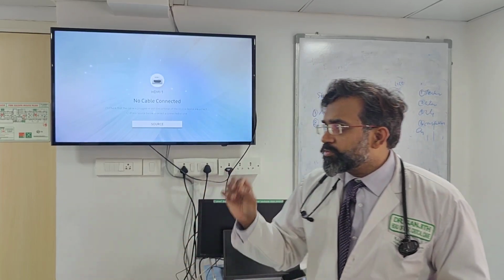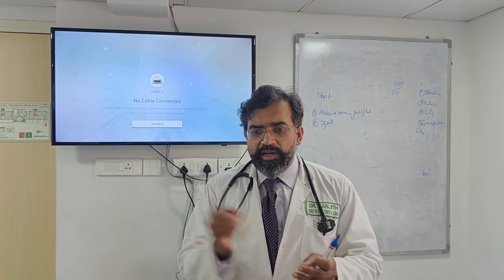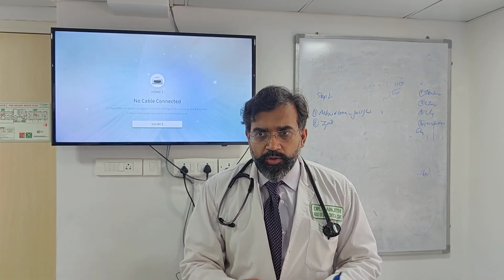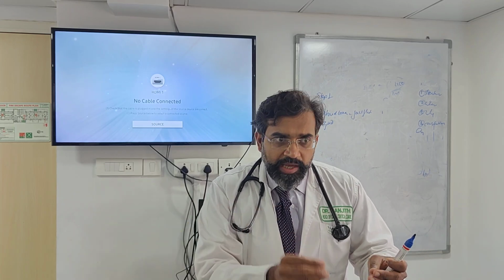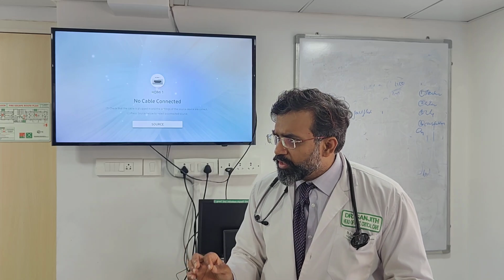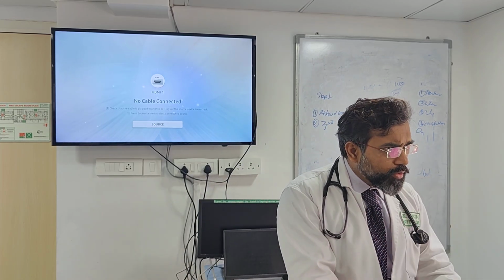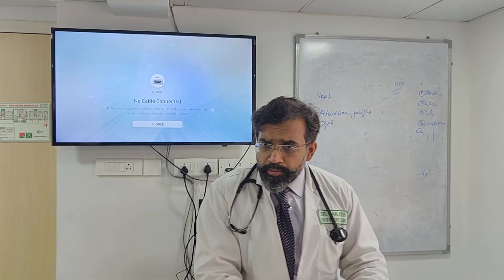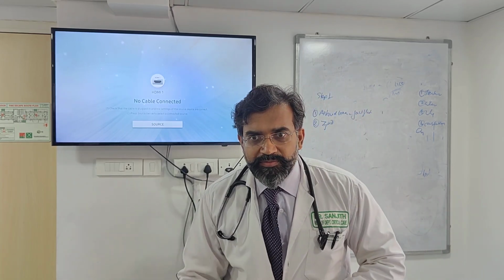So we need to explain to the arterial line what is zero. Then it will tell you if the blood comes, this is the pressure. This is the meaning of zeroing. You are understanding what I am saying? It is basically educating the transducer as to what is zero. If you tell it what is zero, then further it can actually go ahead and tell you what is the pressure. Understood?